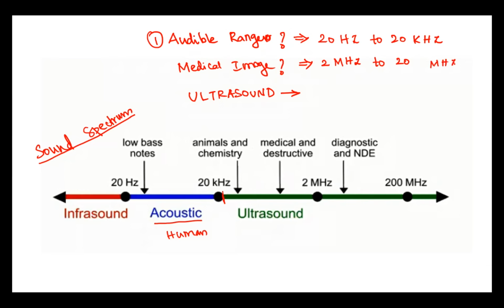Even some machines go beyond 20 megahertz. Okay, so this region is used for medical image.